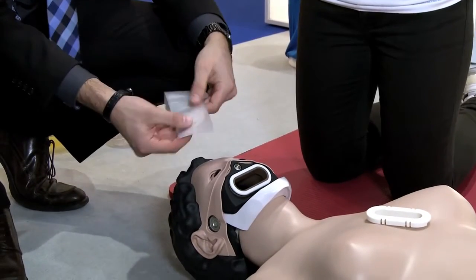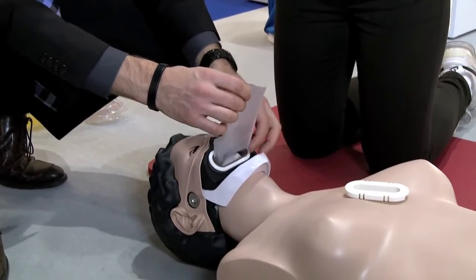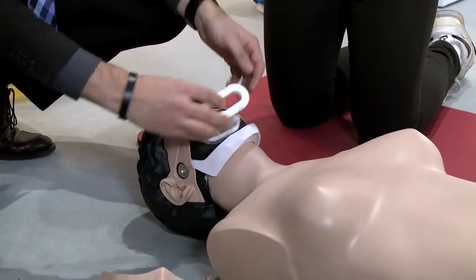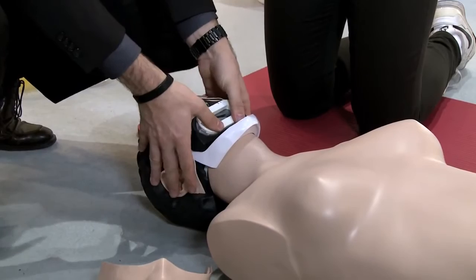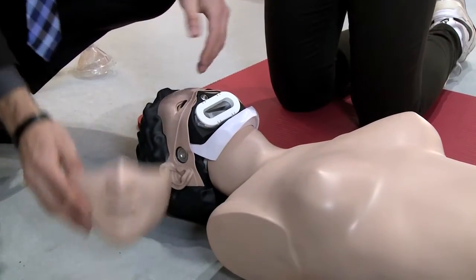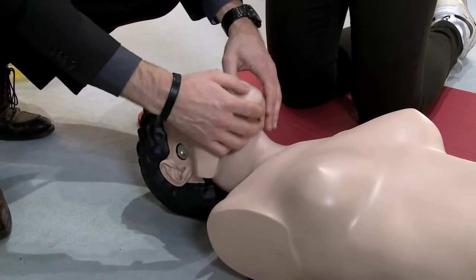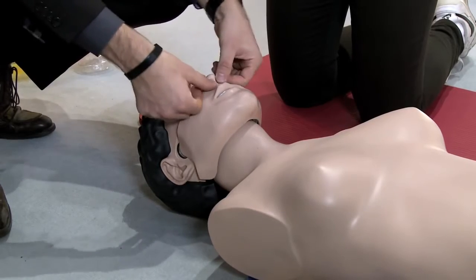The face masks and disposable throat bags are easy to change. The face masks can be cleaned and reused. The throat bags are disposable and can be reordered. Running costs of CPR training can be minimized due to the innovative ventilation system.